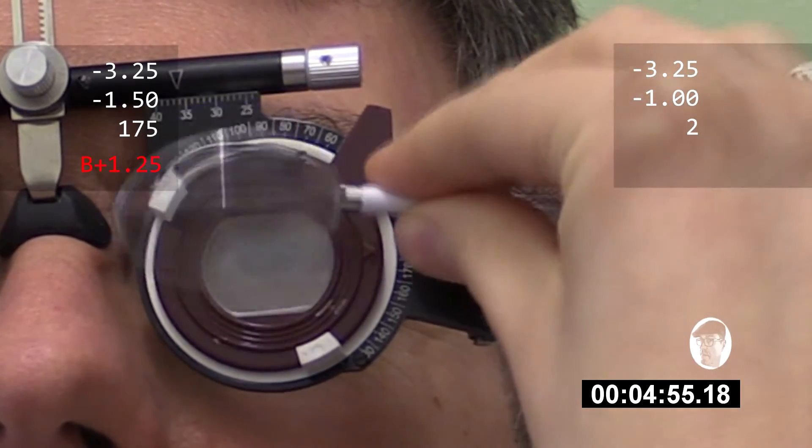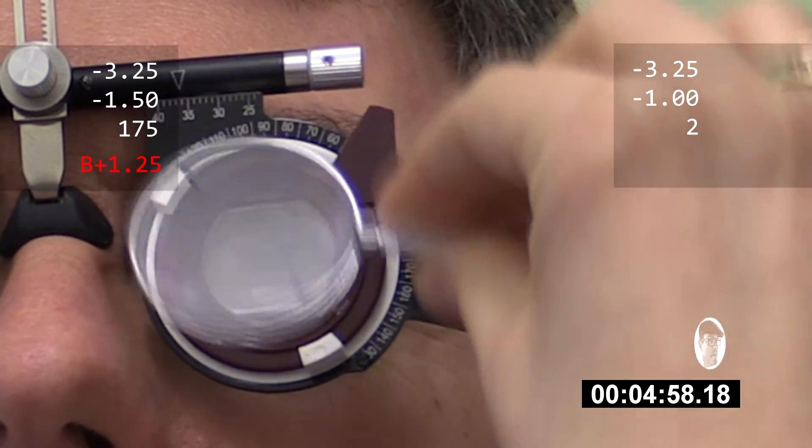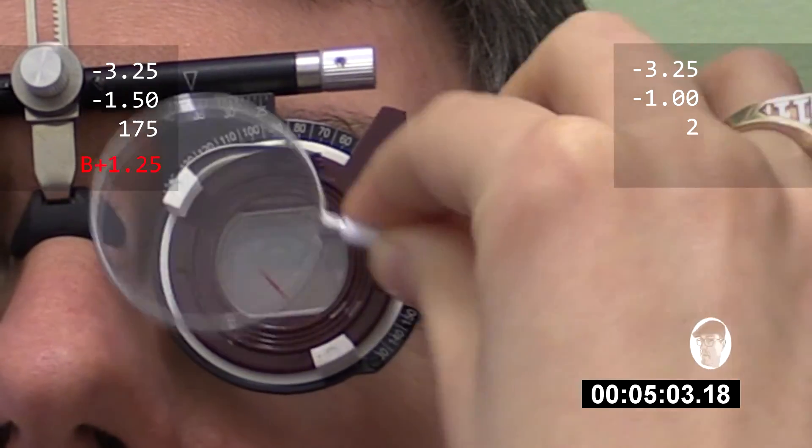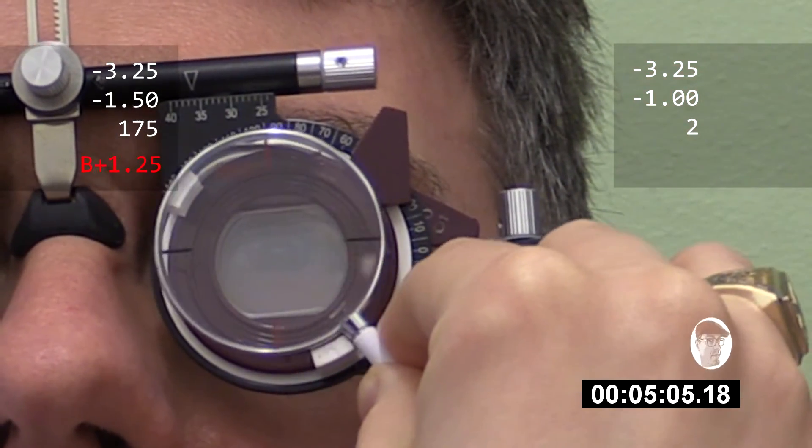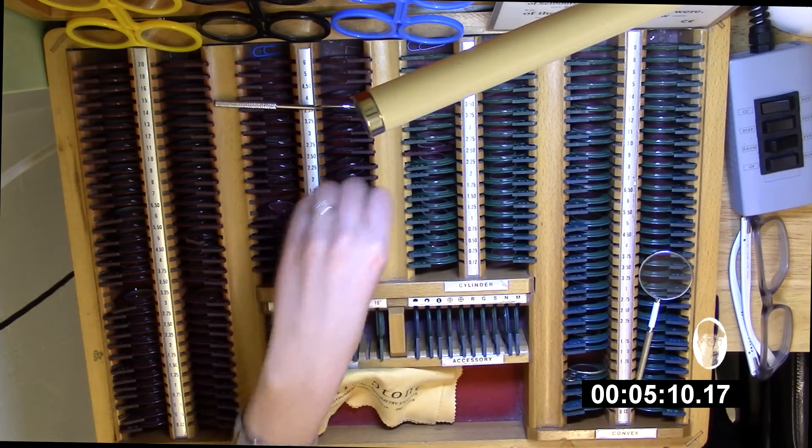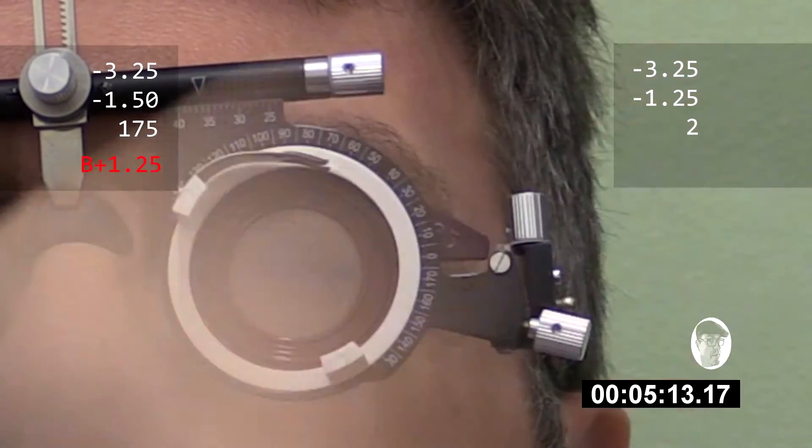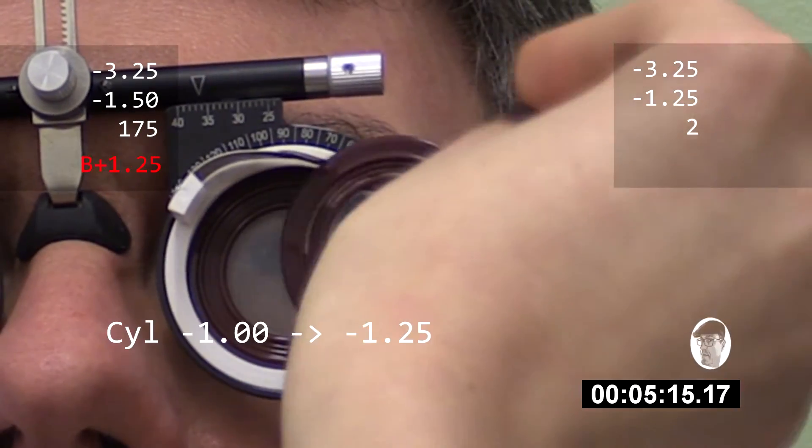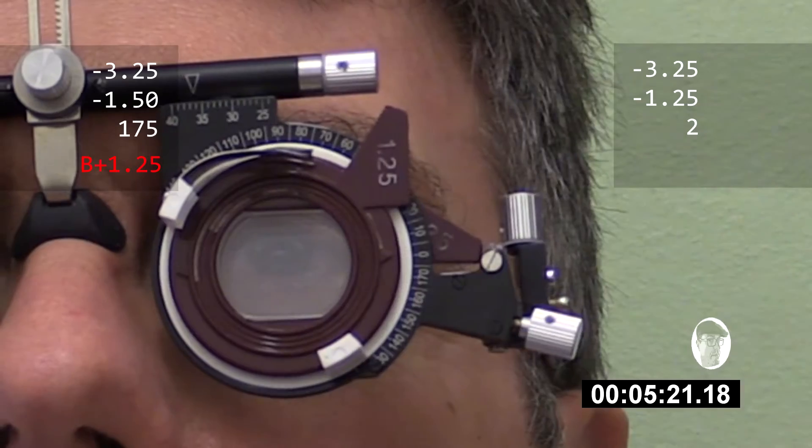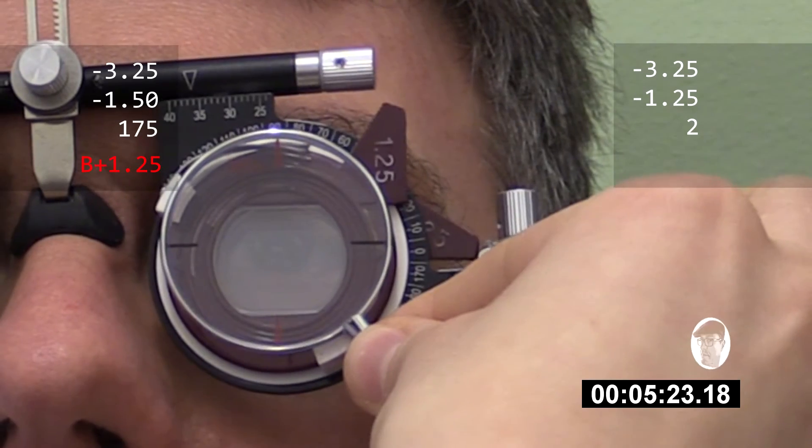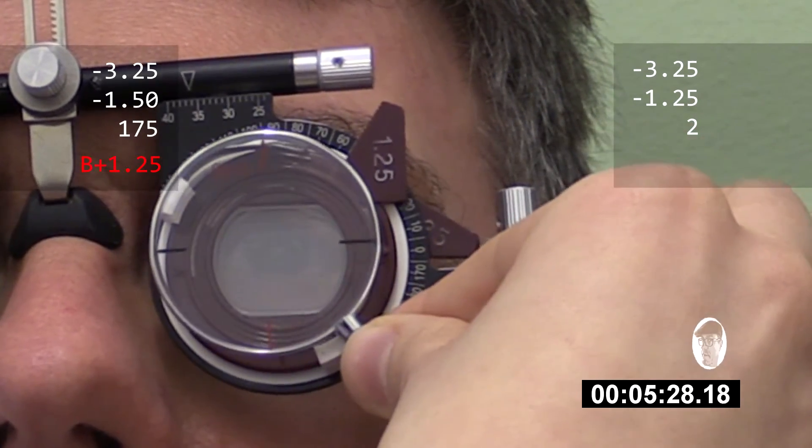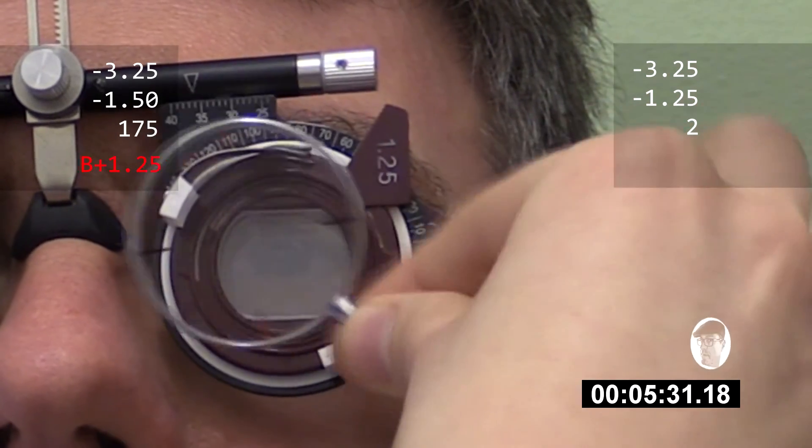And one or two or about the same? Two, slightly, yeah. One or two or about the same? Show me again. That's one, and that's two. Probably nothing in it, I reckon. And what about with three, four, four, four. Okay. Three, four, four, four. What about the same? Show me again. That's three, and that's four. That's eight. Okay.